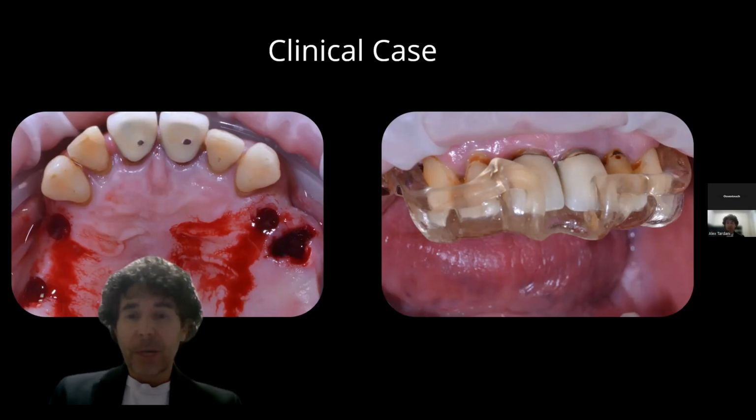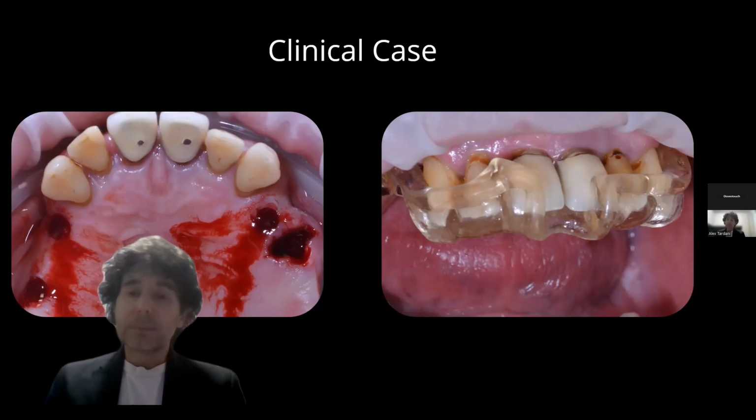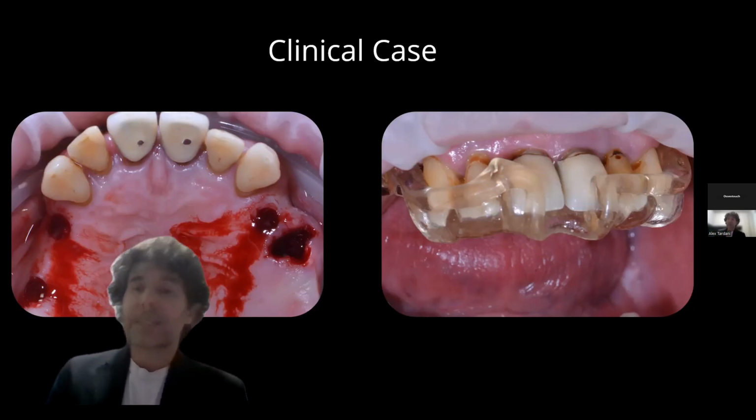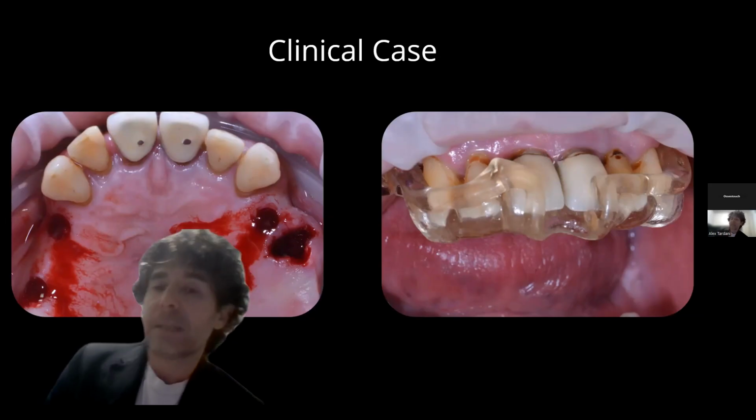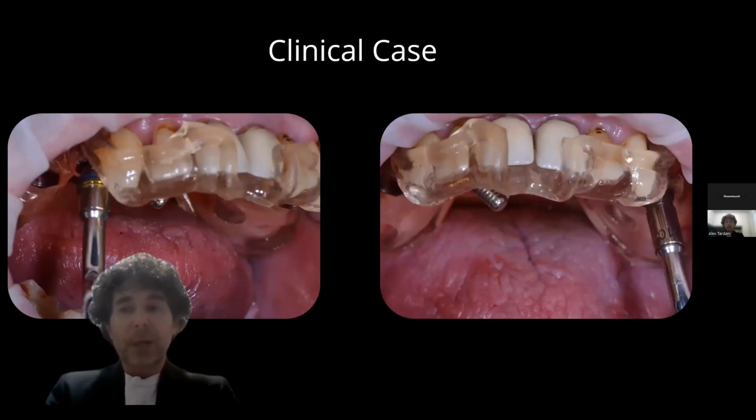I will then show you a video where I demonstrate how it's slightly more complex to use the mallet with a surgical guide than a drill due to the mallet's length. So here we see it in use. On the left, you can see those two colored rings that are used to add the intermediate lengths that aren't available with the standard stops.